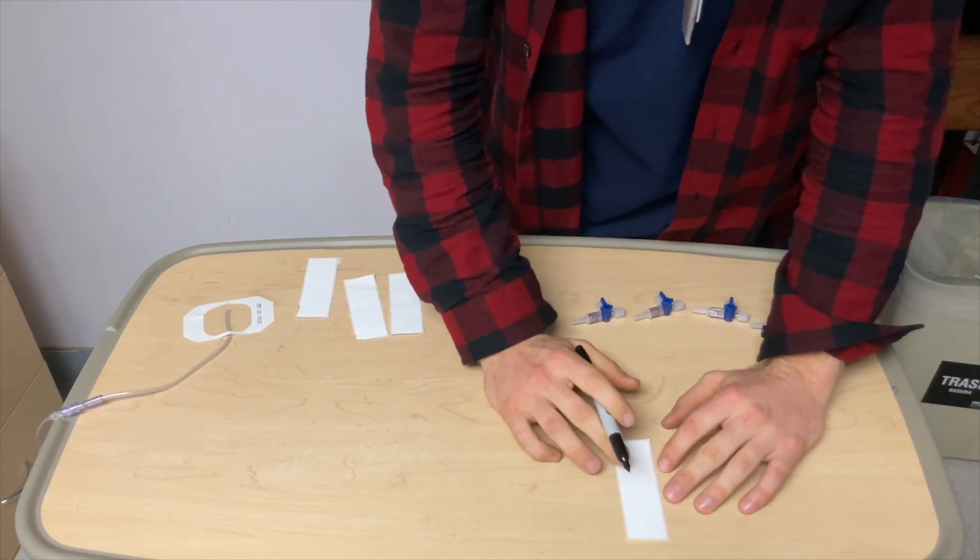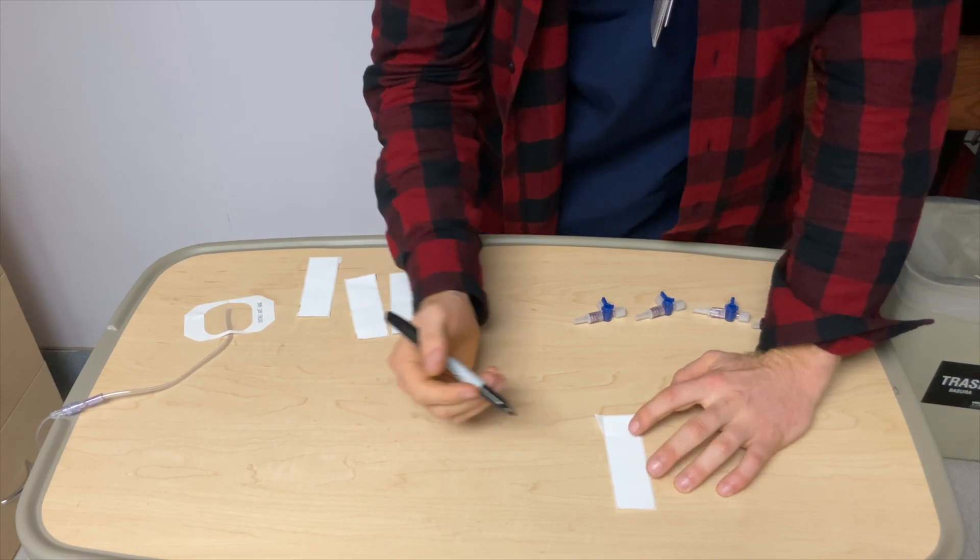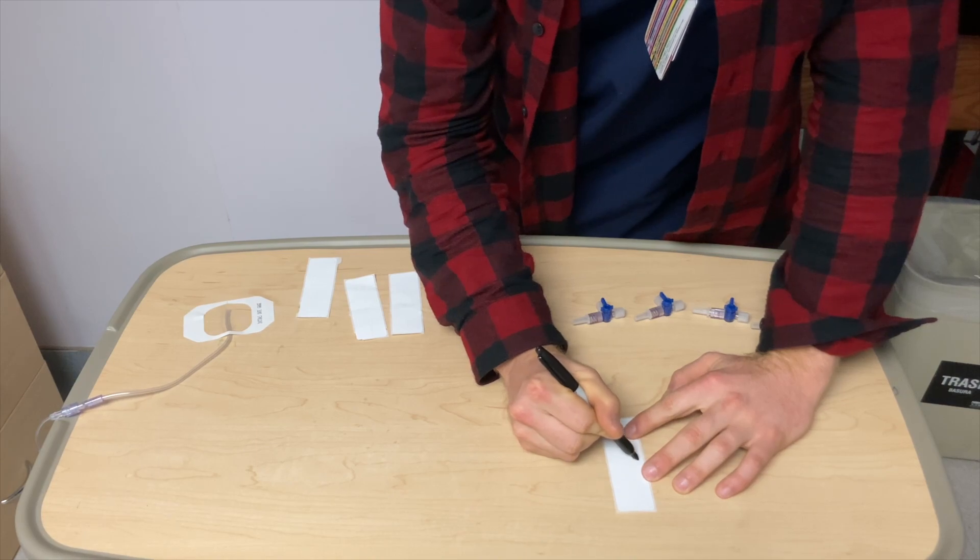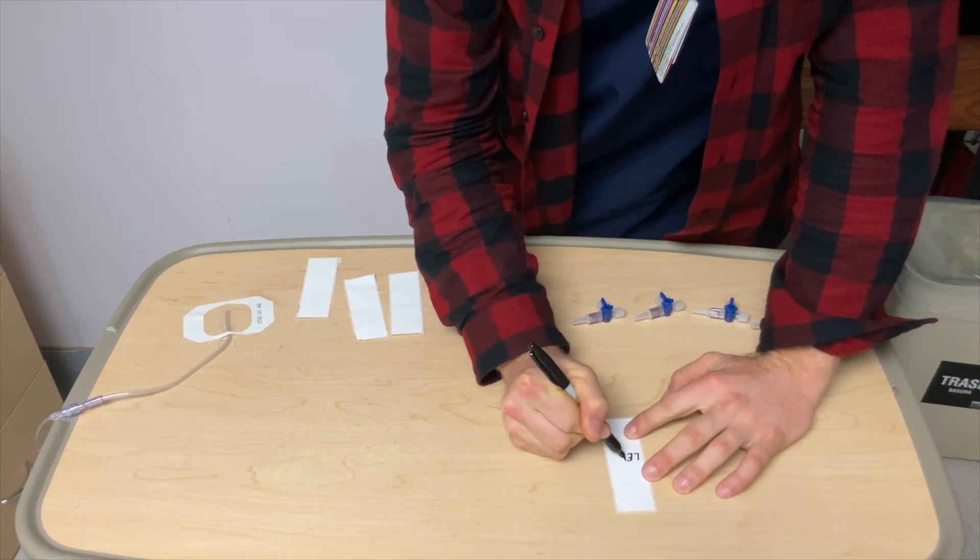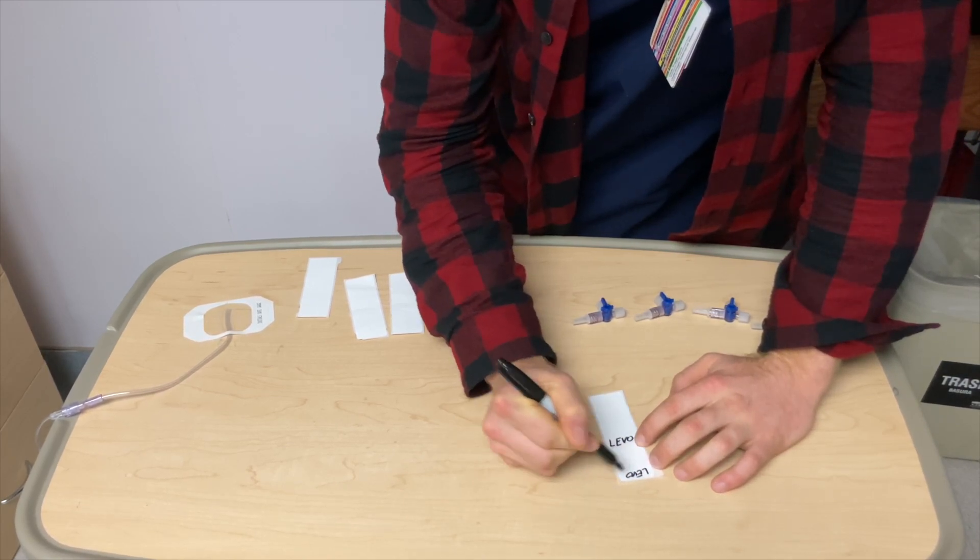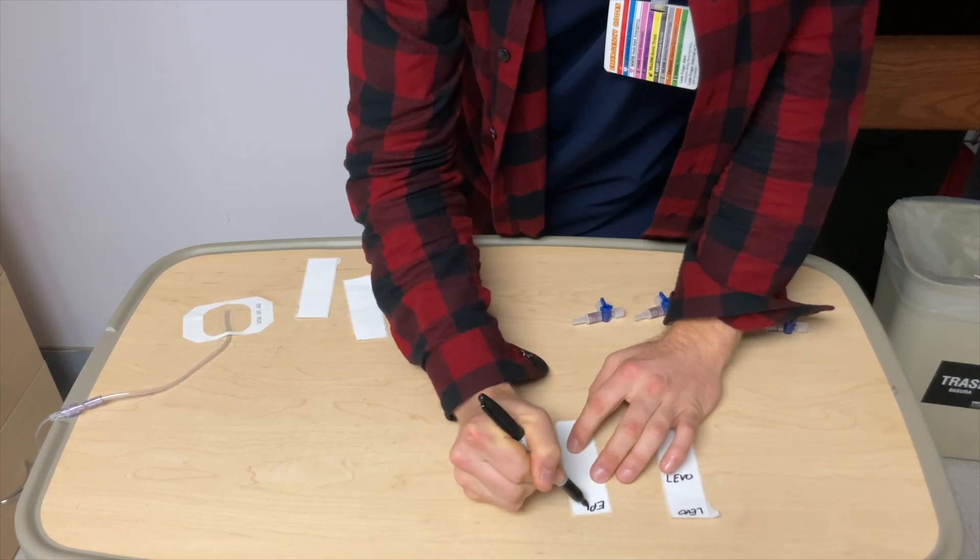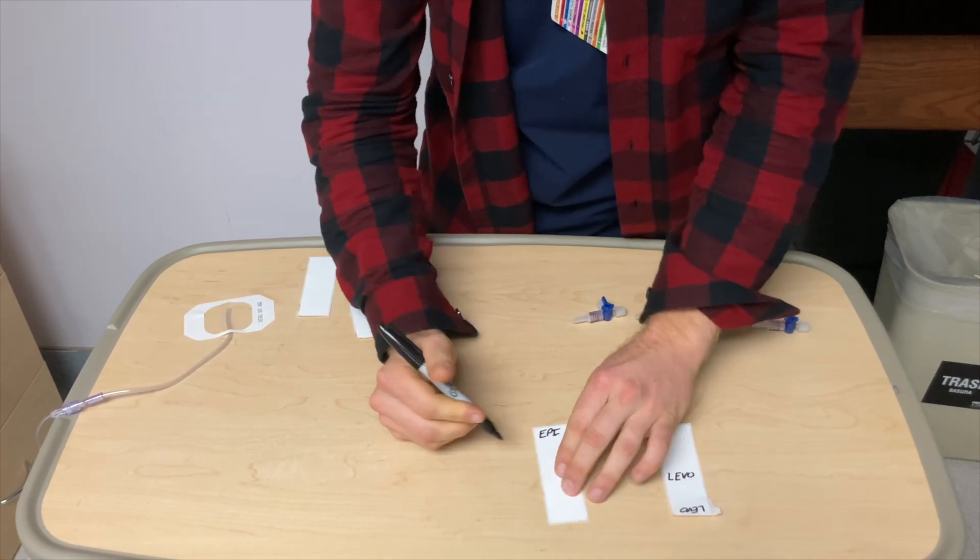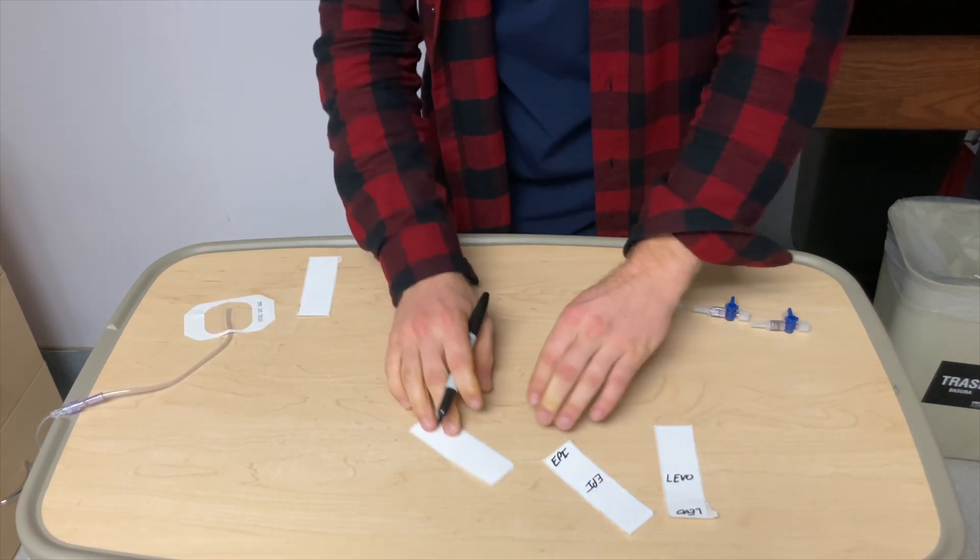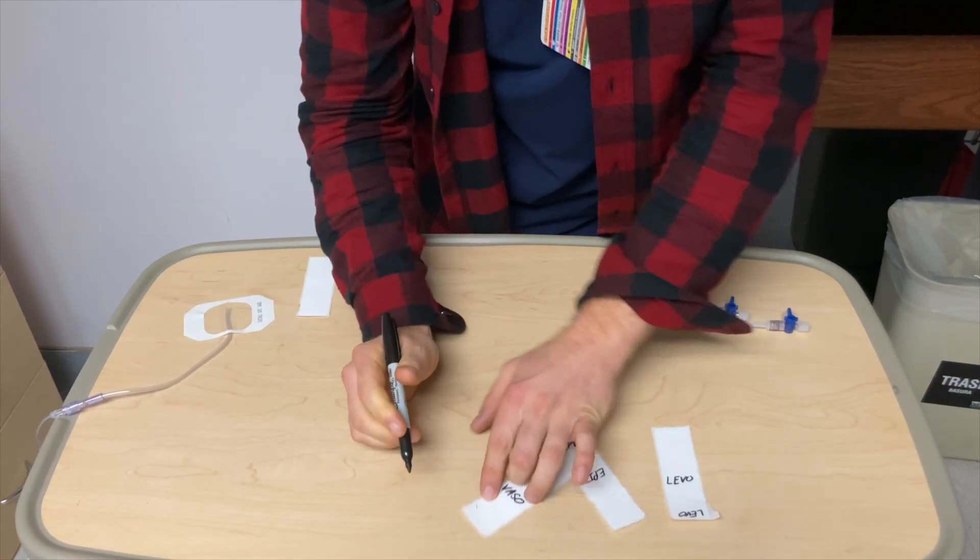So first thing I like to do is I like to grab lab labels because they are waterproof. And so the first thing I'm going to do is for our major vasopressors, so norepinephrine or levophed, I write in all caps, LEVO. I do it like this, L-E-V-O, so everybody can see it. And then we're going to do EPI for epinephrine, like this. And then we're going to do VASO for vasopressin.